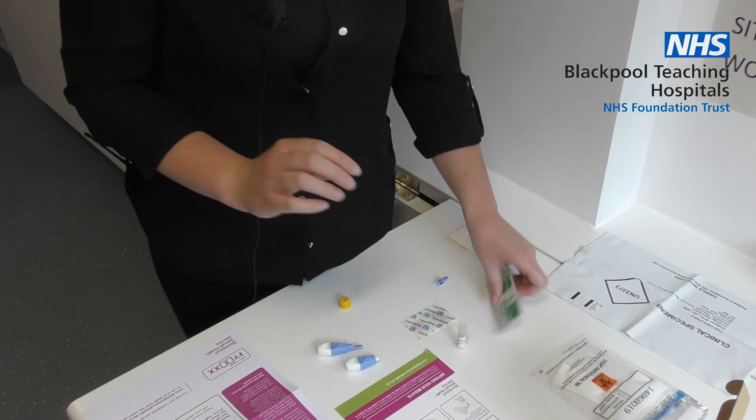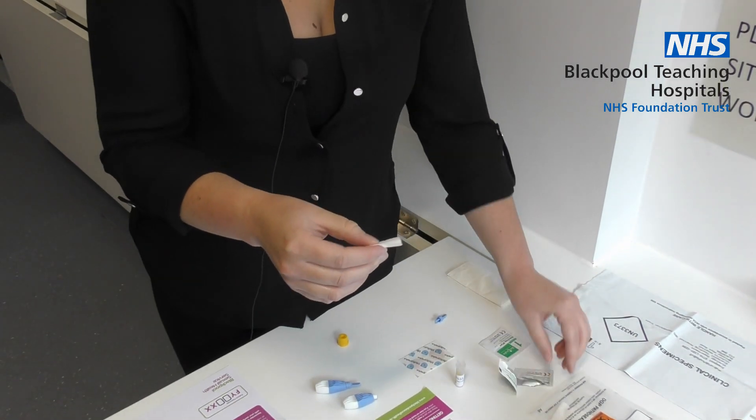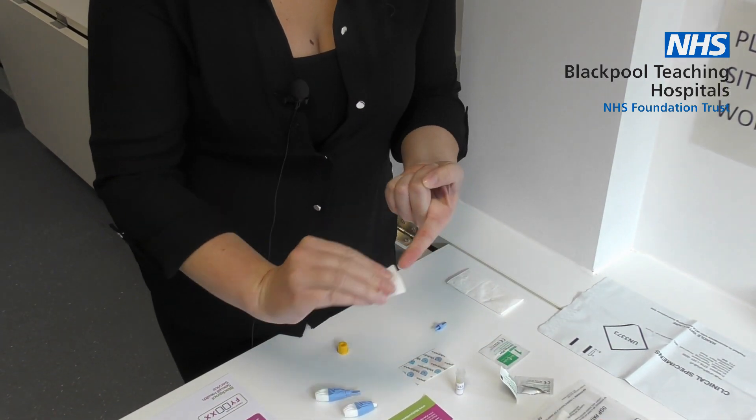Wash and dry your hands. Take your alcohol wipe provided, and clean the finger that you are going to use with your alcohol wipe.